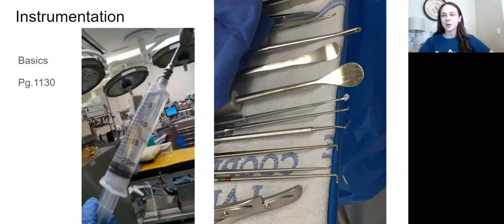So I'll look at page 1130. Yes, you should know all the instruments on this page. It starts by showing you that Hudson drill, I almost said retractor. Your Hudson brace is what they call it, and it comes with lots of different bits. This is what we call a hand drill or more commonly a crank drill. I would definitely write that note down that this is called a crank or a handheld drill. You need to know that because if they just ask you for a drill and you're scrubbed in, you're used to scrub tech things, you're going to be thinking electric or pneumatic drill, right?